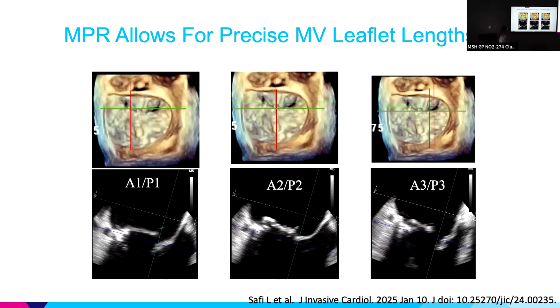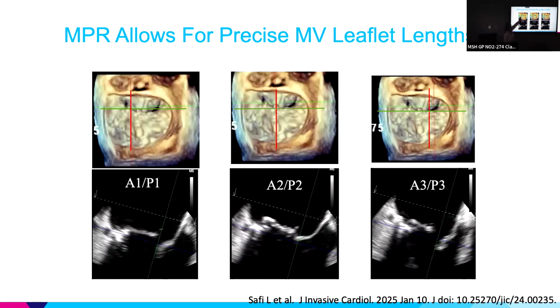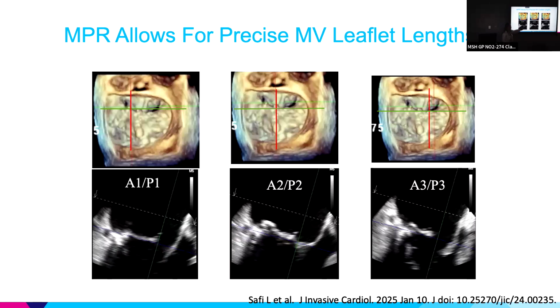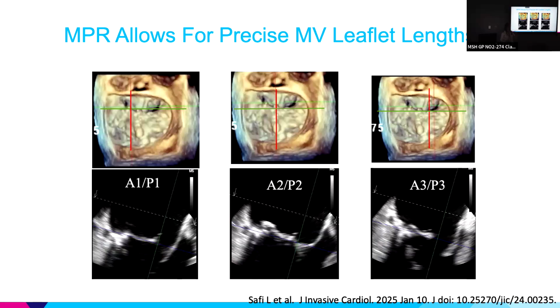This is one of the best ways to sweep through a mitral valve because it will give you 2D and 3D simultaneously. So I will know exactly the orientation of where my clip should be and the exact image at that location. I'll be able to freeze frame, measure, do whatever I need to, and say, yes, this patient is clippable. We did clip this patient.